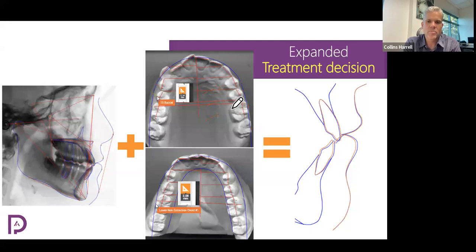So we want to be careful as we apply expansion, and we're going to want to ask the technicians to apply extra force on the roots. Okay, so obviously the aligner is not pushing on the roots, but the aligners are going to be set up in such a way that basically it's pushing harder down at the gingival level on the lingual side than it is on the cusp tip. Okay, so that it's basically trying to push the root more to the buccal than it's pushing the crown. So as these teeth expand, we want to see the crowns kind of tipping to the lingual as they move to the buccal bodily, and it's going to look like the roots are moving more to the labial than the actual crown is.